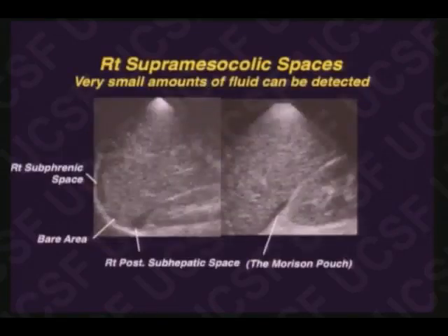Now, I will make this point many times. Volume is not the issue. You take your CT scanner, your MR scanner, your nuclear medicine scanner, your fluoroscope, anything you want. I'll take my ultrasound machine, and we'll see who can find the smallest amount of fluid, and by noon, you'll cry uncle. Okay? Ultrasound is the greatest tool ever made to find fluid.